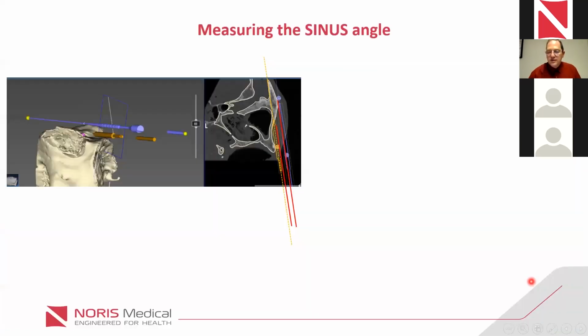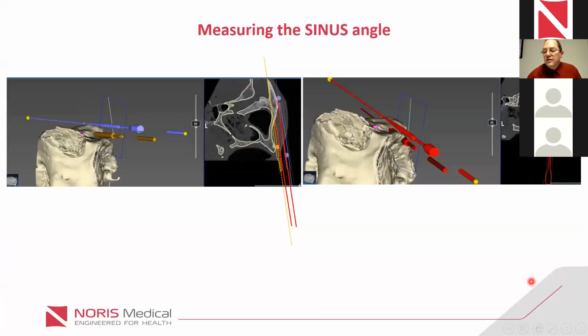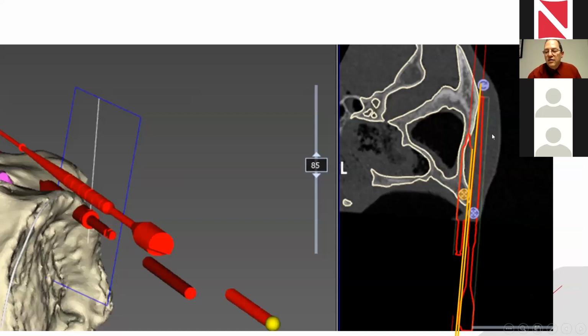What we need to do in this case is either take the diamond further down or move the entering point. But if we took it further down, we might come to a situation like that where the implant ends up on the external of the bone. We're going to perforate the bone here. This is why we need to keep this point correctly measured, as I said before, and move the entering point.